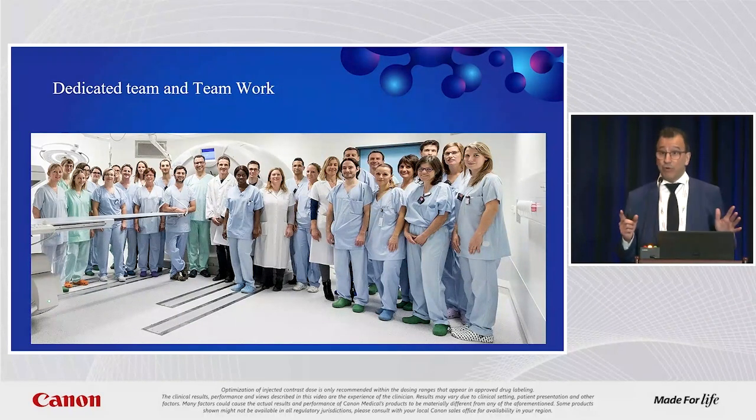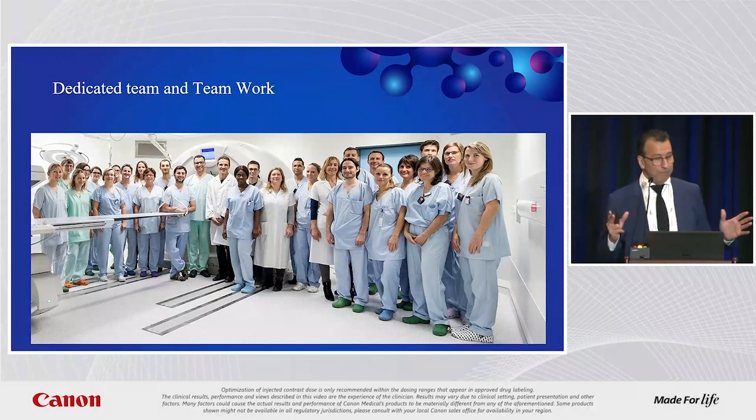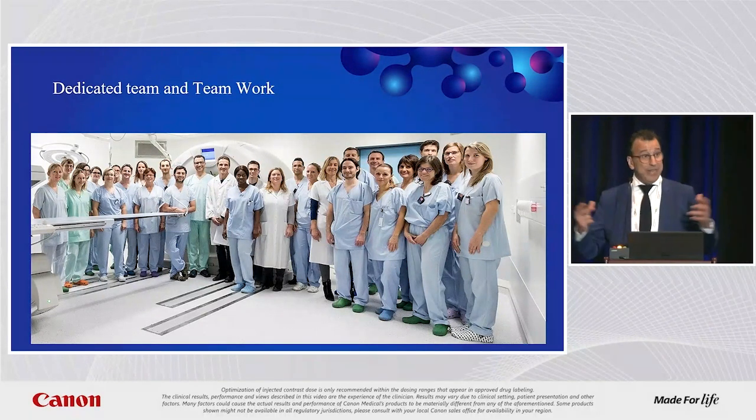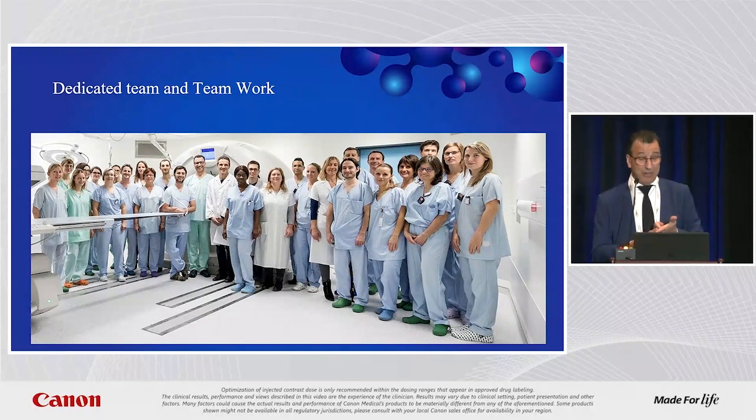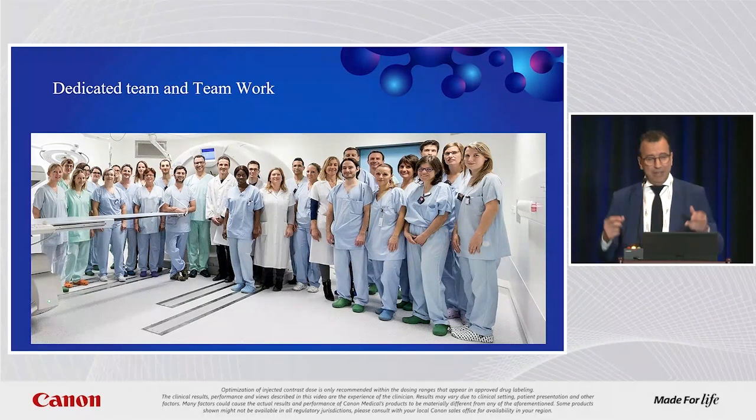And I'm not forgetting the ultrasound. All this system for complex cases opens up a new window for complex interventions and brings all specialists around the patient. Anesthesiologists for sure, surgeons can come in, neuromonitoring is coming in. For difficult cases, we put the patient in the room, you have all the settings and you can really push the boundaries comfortably because anytime you need angio, you come to angio. You want to go back to CT, you come to CT.